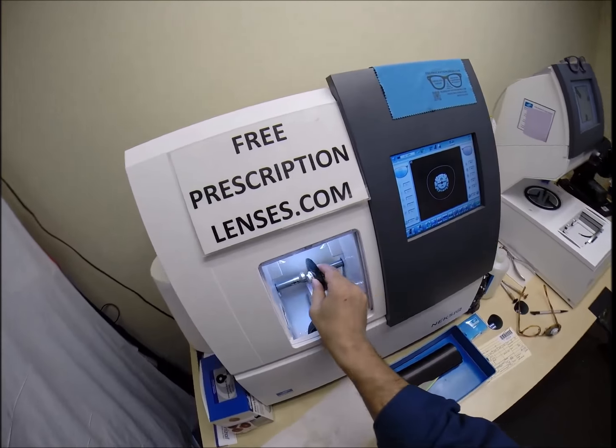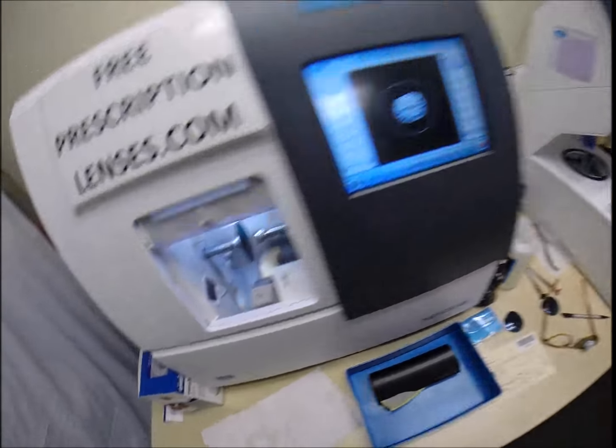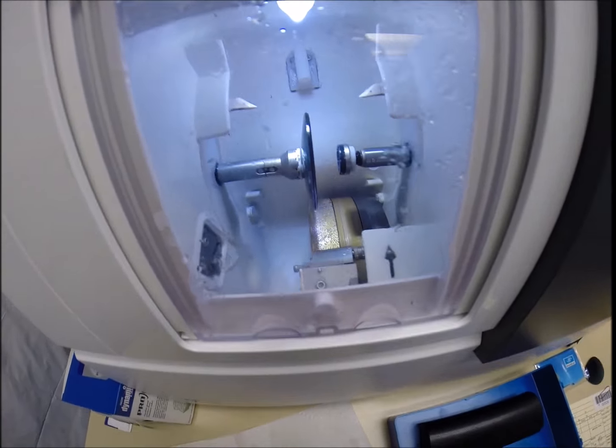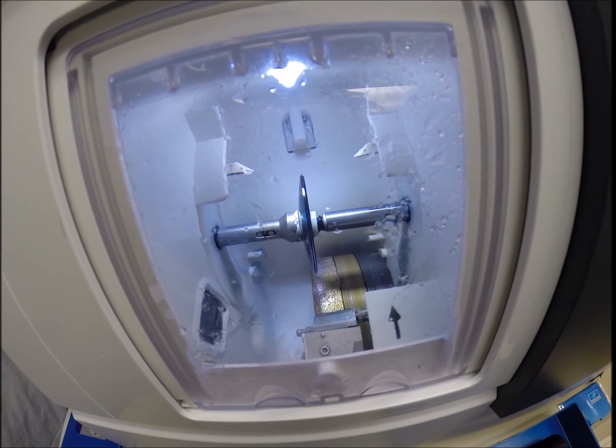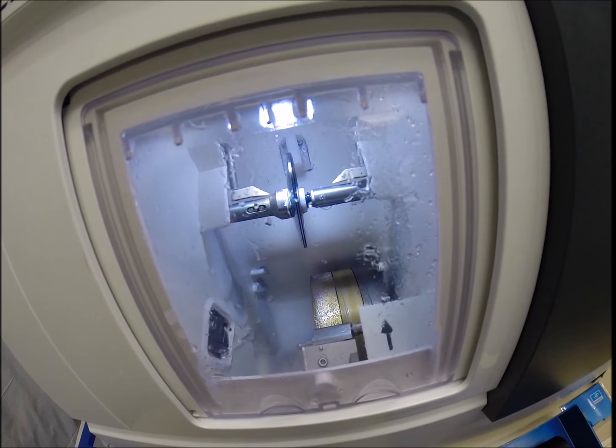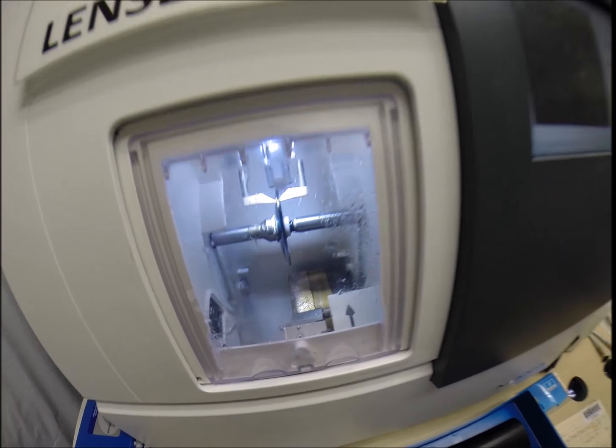Press that on there firmly. Hit the green arrow, which is start in every language. Just like before the door closes, the clamp shuts, and then the lens is going to be traced by the two white styluses, once again, just to make sure the lens is large enough to fit into the frame.